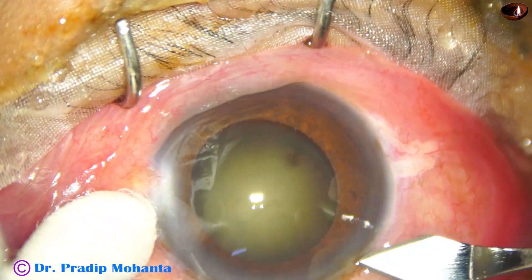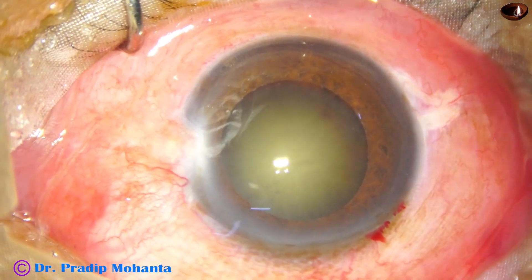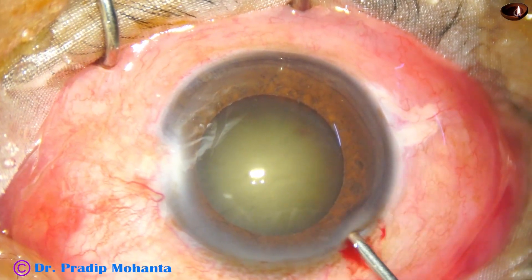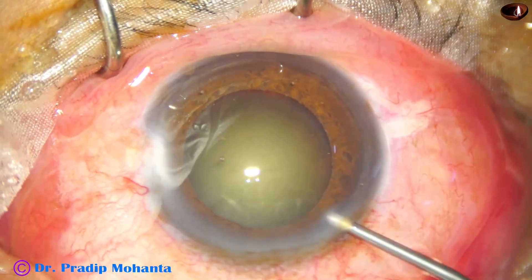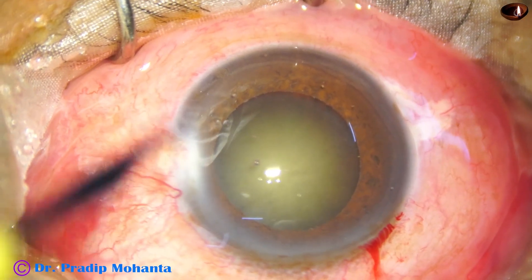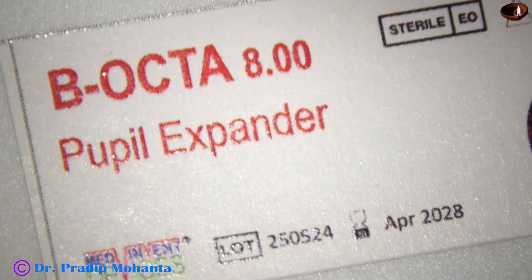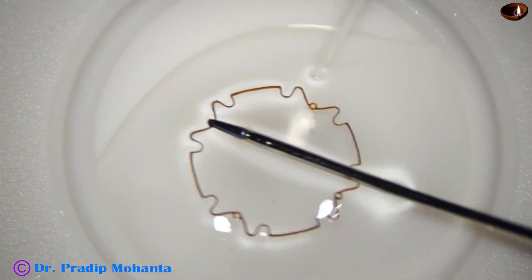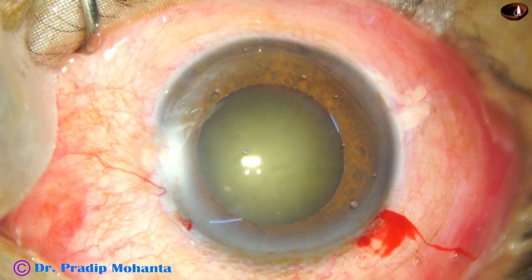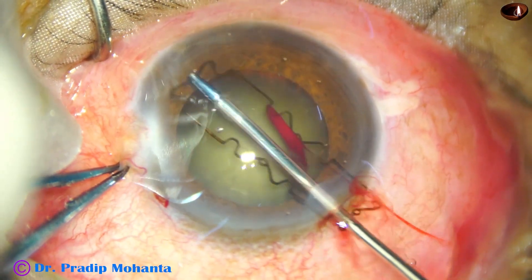We have an idea that these devices are only for dilating the small pupil. But there are situations like this cataract with pseudo-exfoliation and extremely weak zonules. In this case, I have to do many maneuvers like applying a CTR and aspirating the cortex. Better visibility is very important for such cases. So I am going to use a B-Octa here, though the pupil is dilated to about 6.5 to 7 mm. The B-Octa will keep the pupil dilated to about 8 mm, and visibility will be much better in all steps of the surgery.